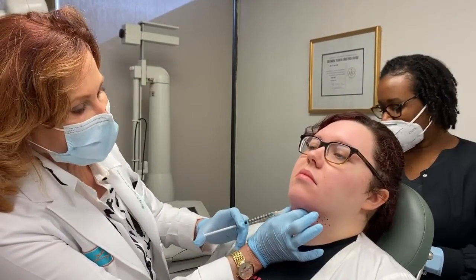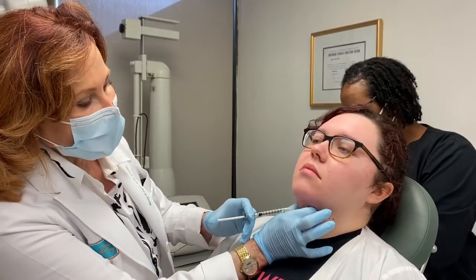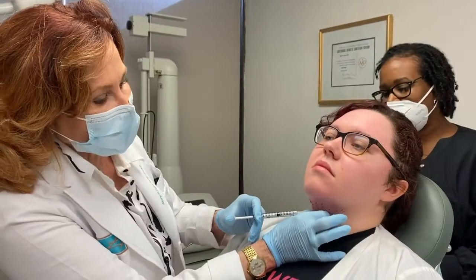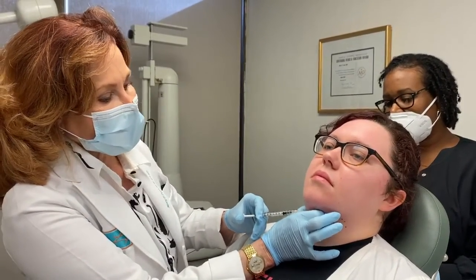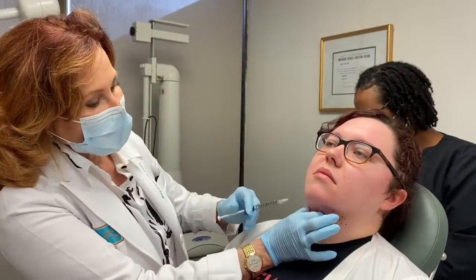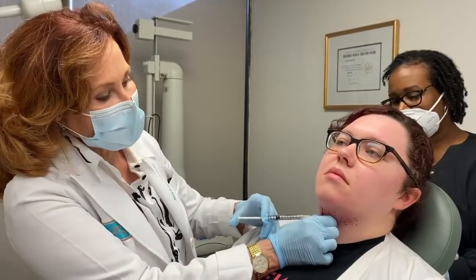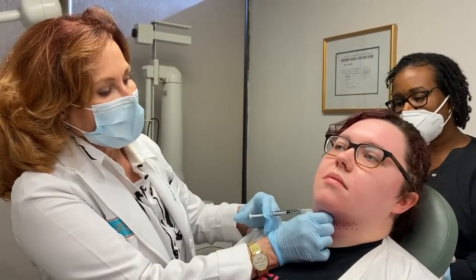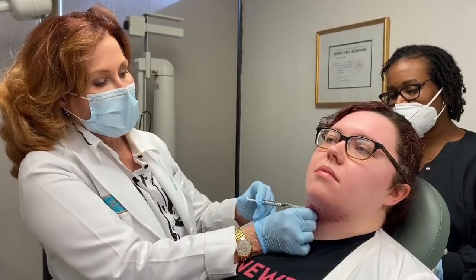It's important to pinch the skin and go all the way down, following the grid. I usually don't stick inside the actual spot that the grid makes, but rather I tend to go alongside of it. The grid is meant to ensure you haven't missed anything, because ideally you want these injections about a centimeter apart. Especially when you're near the jawline, you really want to pinch and pull it forward.